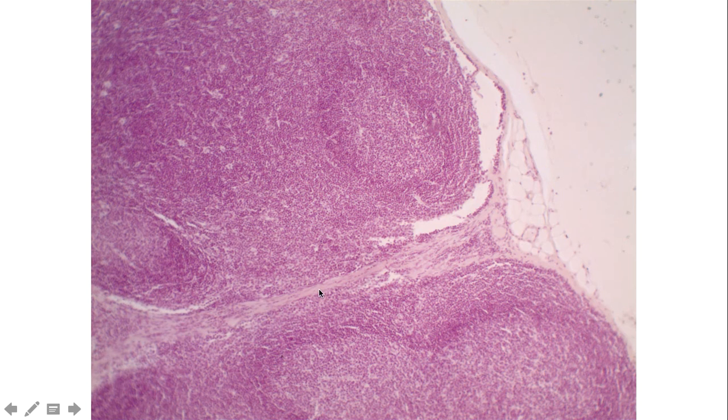And these, as you'll notice, are much, much smaller than the hilus, right? The hilus was a large indentation of the whole lymph node. Here we just have a small little dip within the capsule that separates these two follicles. And so this trabeculae is going to be this extension of the dense irregular capsule down a bit into the cortex.